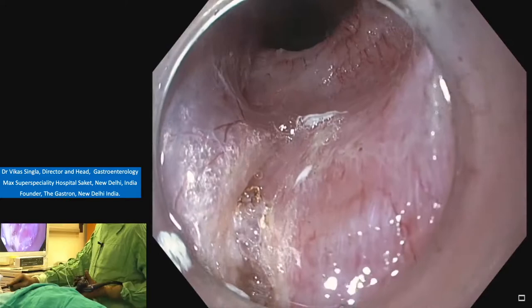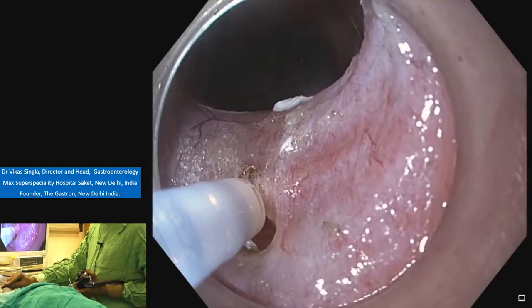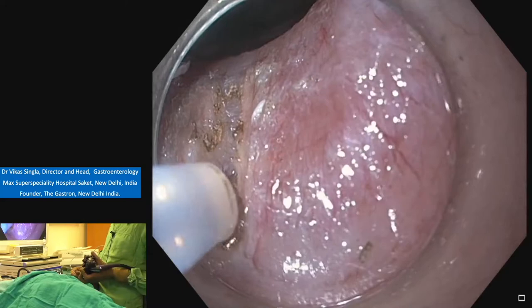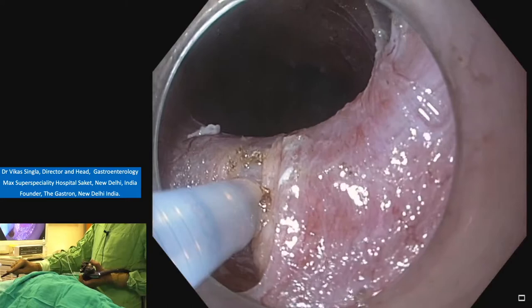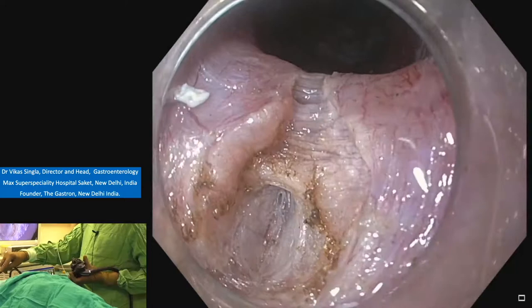Okay, so we have to still go deeper, knife out, lift and cut, lift, coagulation, and then cut. Now you can see the transverse fiber, thick muscle layer. Go below it, lift, coagulate. Last part, one can use the cut. Cut is faster. Now you can see 2 layers. One is the longitudinal below and the transverse above.